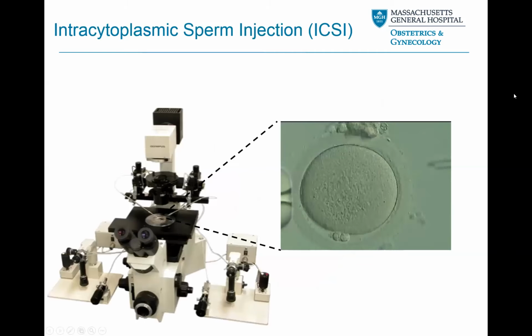So here's an actual ICSI procedure. So when people say ICSI, they're saying intracytoplasmic sperm injection, big fancy word for sticking that sperm directly into the egg. So here's a quick video, and I hope it works for you guys. Okay, let me click on it.